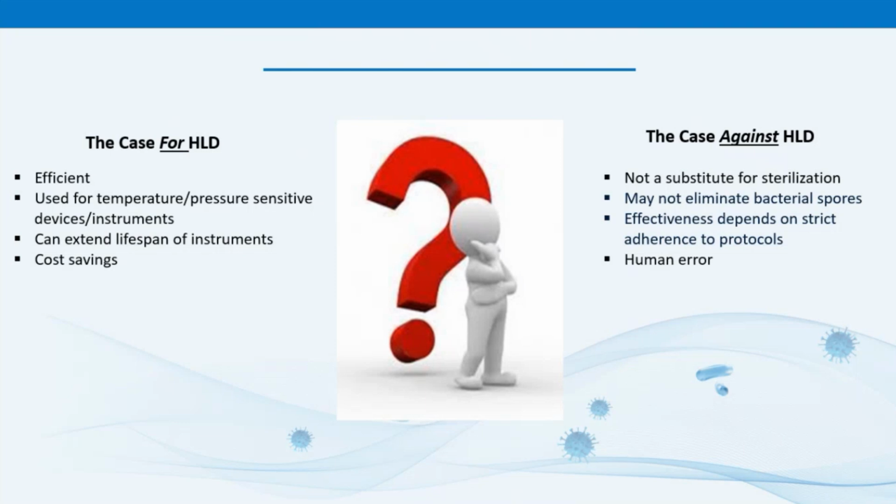Now, this efficiency isn't only operational. It can lead to a substantial cost savings by reducing the need for single-use instruments or the need for additional inventory to accommodate longer sterilization cycles. Another reason in favor of HLD is that it can safely reprocess devices made from materials that are sensitive to the high temperatures and pressures of sterilization.